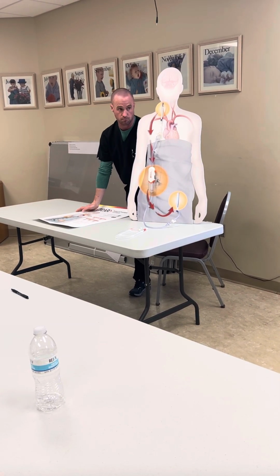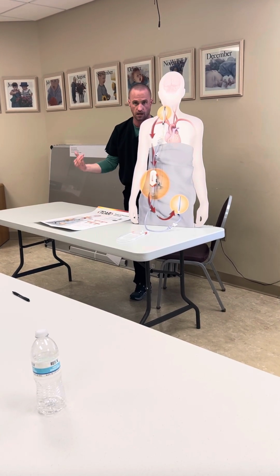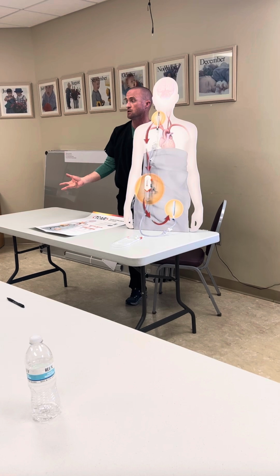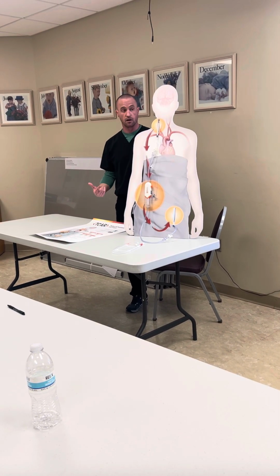But everything usually is prepped and ready before the case starts. Dr. Reiser is really good about that. We try to minimize how many things we're trying to hand off during the procedure, just because, again, time is of the essence, especially when we're clamped. We'd like everything to be on the table.